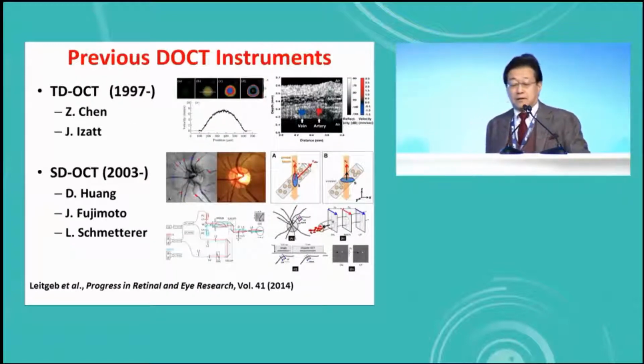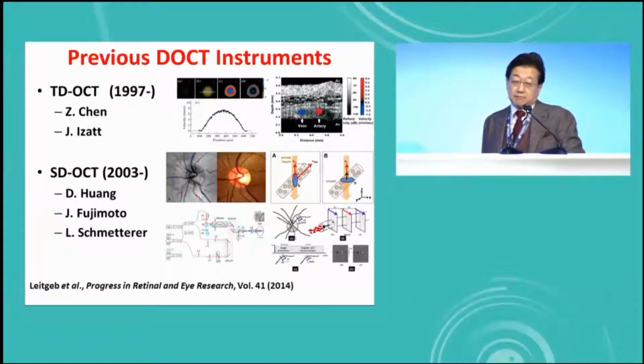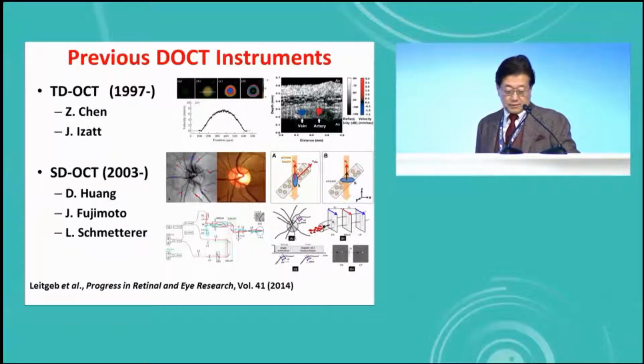If you look at the papers, previous Doppler OCT instruments have been reported by very scientific doctors, as shown in this slide. But no clinical-use Doppler OCT, DOCT instrument was available.